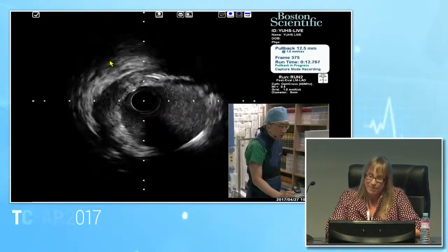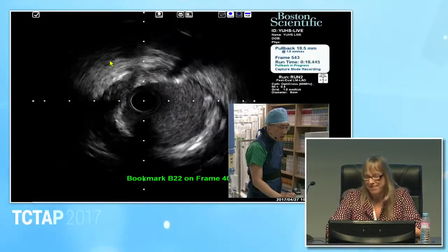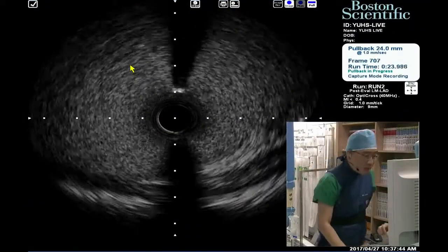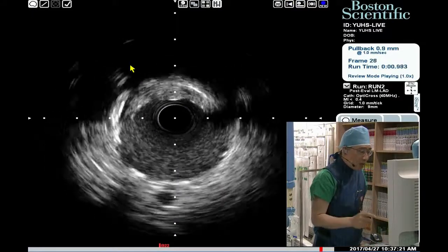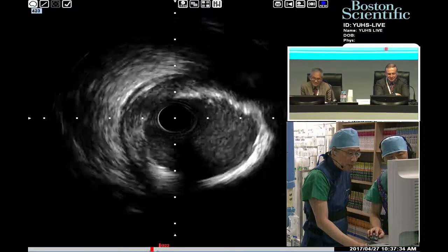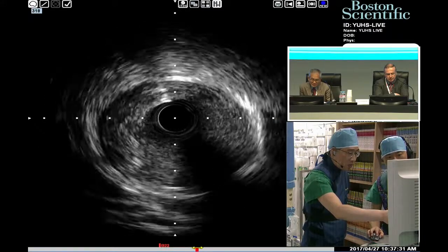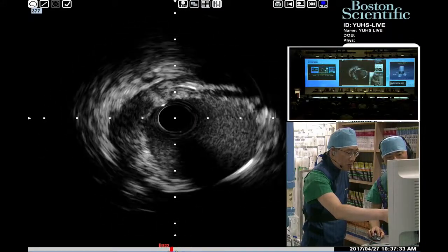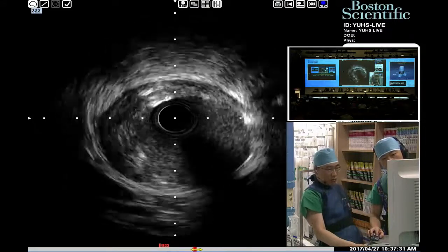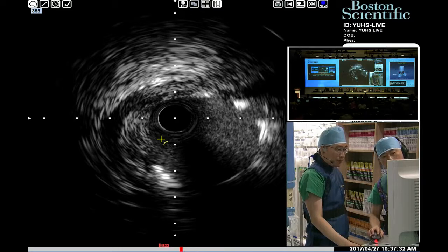Actually, one of my friends said PCI is a contrast and angio-based procedure, not IVUS-based. It's more expanded compared to before. What is the opinion about this IVUS? Let me check the area again. If there were some hemodynamic change, we had prepared the pressure wire for the obtuse marginal. But from a practical point of view, nothing happened, so we don't need the pressure wire, which saves resources.